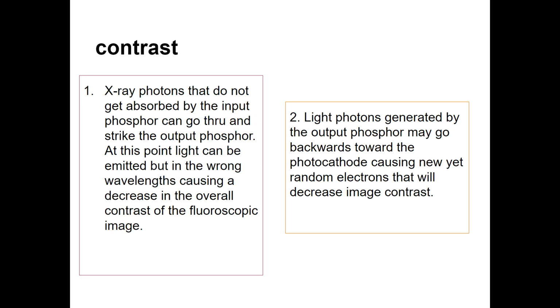So this system doesn't always work perfectly. That's why in part 2, things work a lot better in the DR version, but image intensifiers are all over the place. Have you seen any of the C-arms parked? Have you seen any where the C-arm is square? Most of the C-arms are round and have that image intensifier. So that's older technology. We're talking about pretty new stuff when it comes to digital fluoro. You're going to see more and more digital fluoro. They just haven't made it to the C-arms yet, but they're being installed in rooms. Everything always starts off more static and then goes mobile.